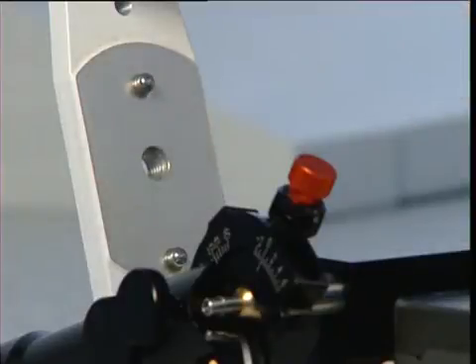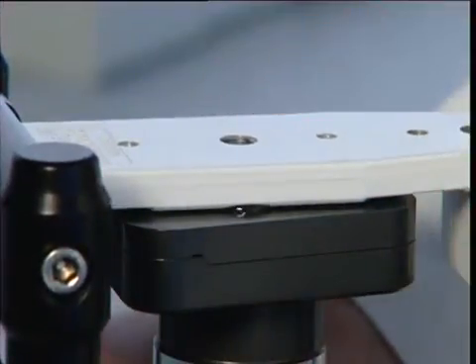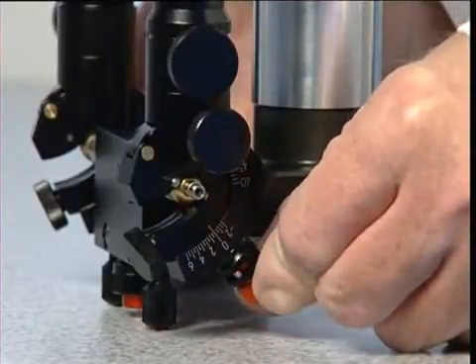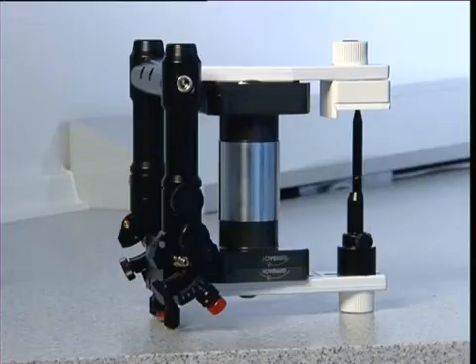Spray a thin coat of activator onto the surface of the articulator. Close it immediately and lock the centric. Place your index finger close to the incisal guidance pin on the lower member and exert gentle pressure for 15 to 30 seconds. Allow the adhesive to set for 10 minutes and remove the split-hex plate.